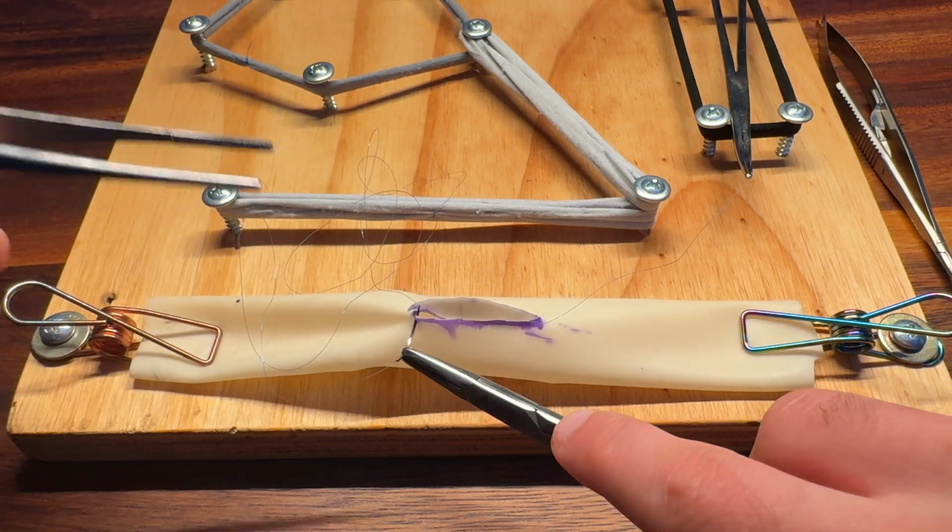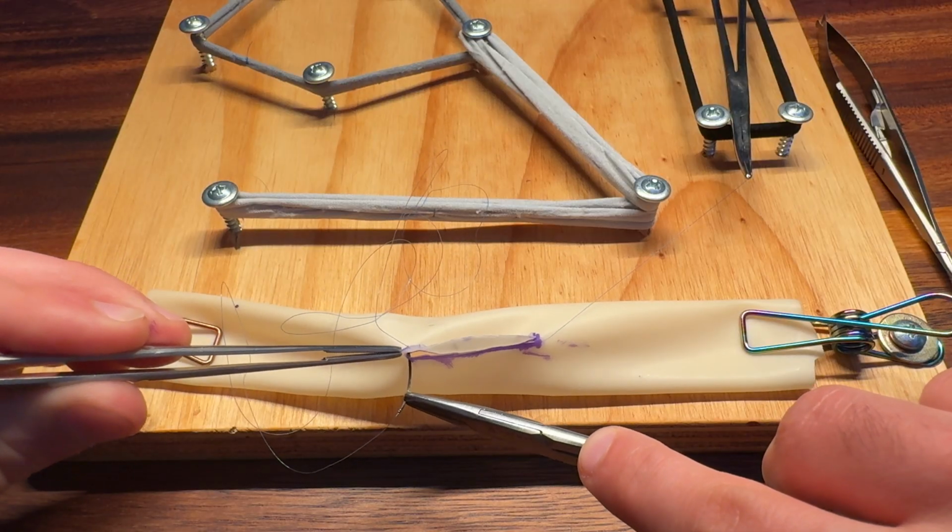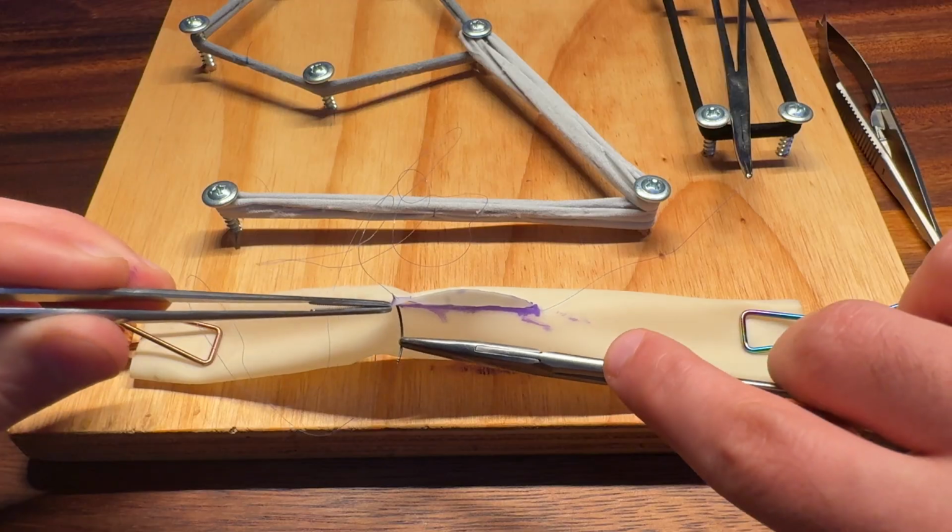So once I come out of the apex, I want to make sure I'm coming into the apex here on my patch. So something like that.